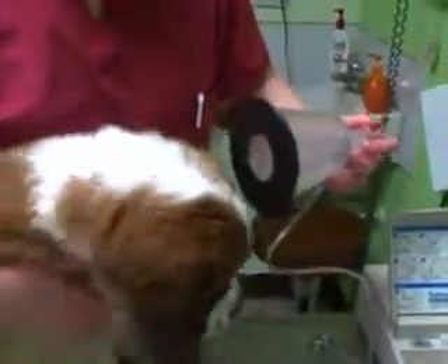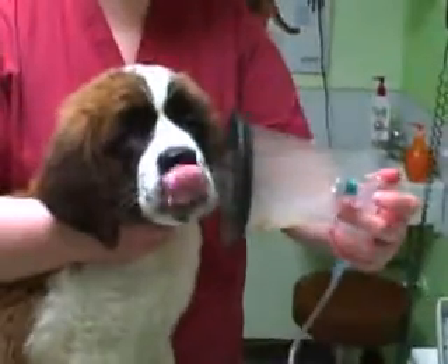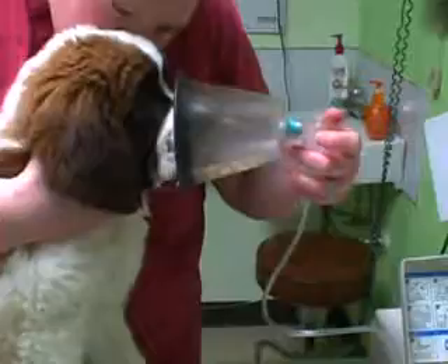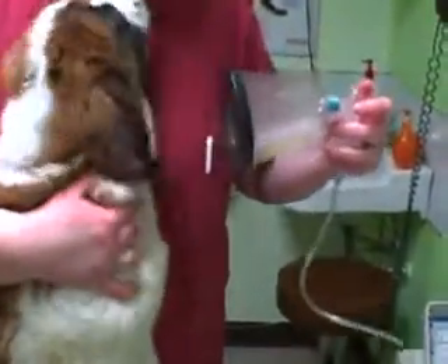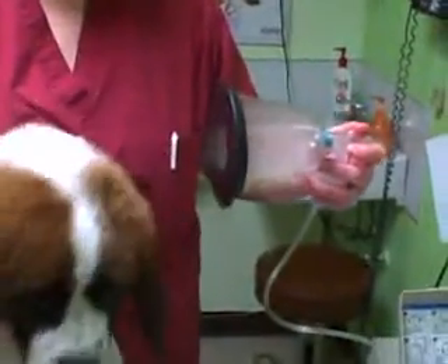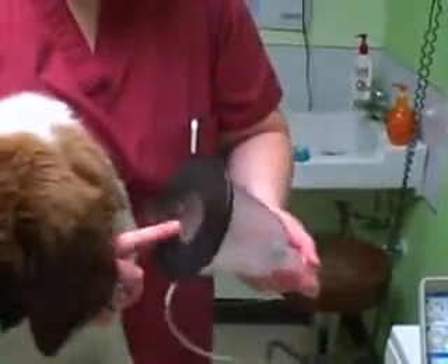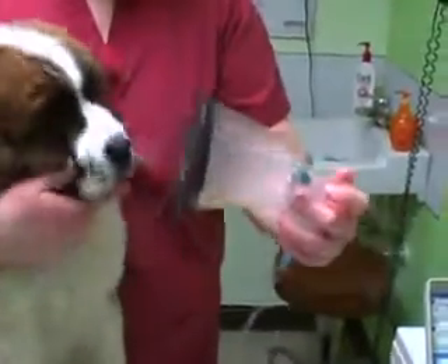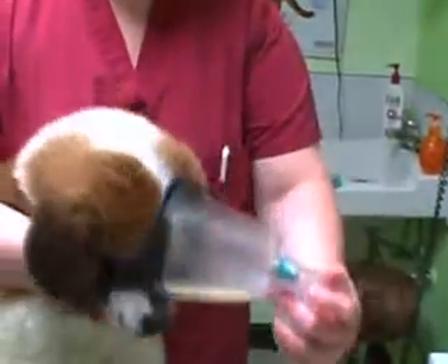It usually takes around 10 to 15 minutes for most nebulizers. We don't suggest using the handheld nebulizers because they're too clumsy. As you can see, it's hard for one person to restrain the pet as well as hold the mask on the dog. So if you have a long tube or you're trying to hold a small handheld nebulizer as well as the mask, it's going to be difficult.